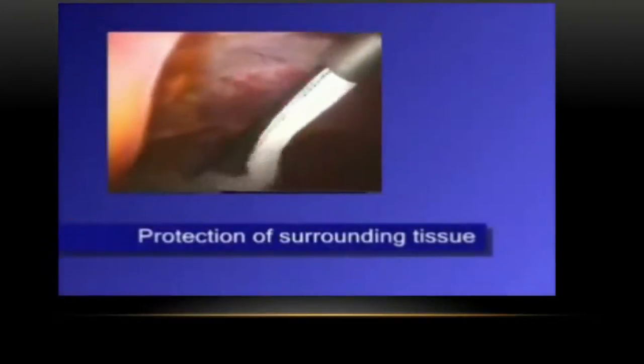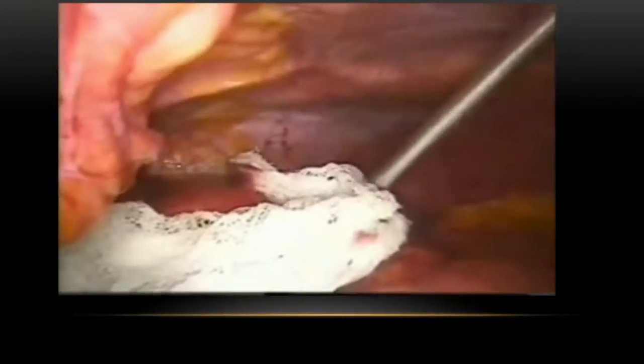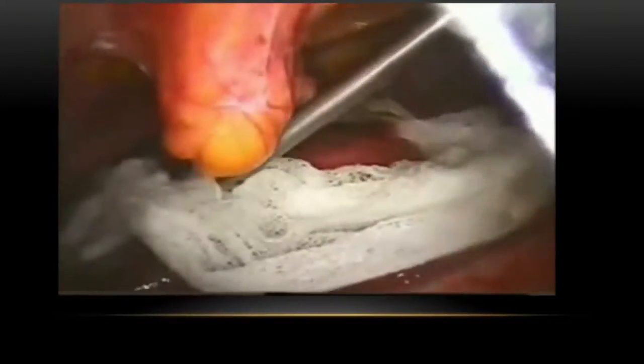Do you know, sometimes it is psychological, how much it will protect against spillage, we don't know. But always putting a gauze piece will be appreciated, even in the dermoid cyst, even in the endometrioma. And then you can put a lot of hypertonic saline. And then you will cut it and take the germinal layer and all the daughter cysts out.